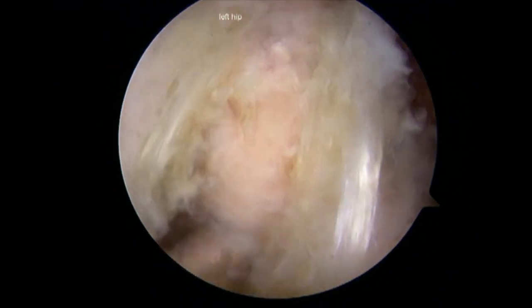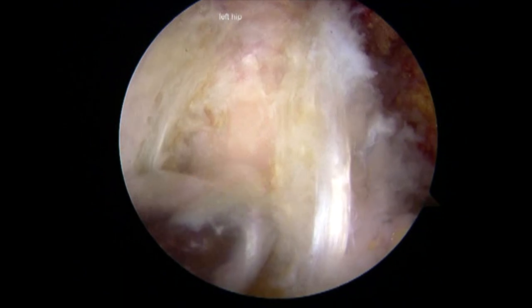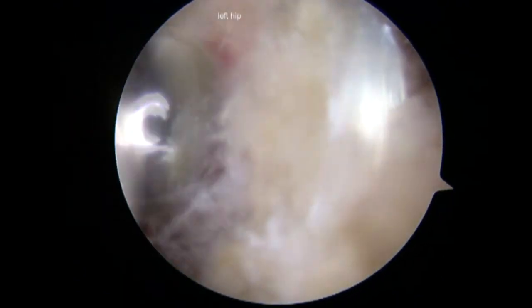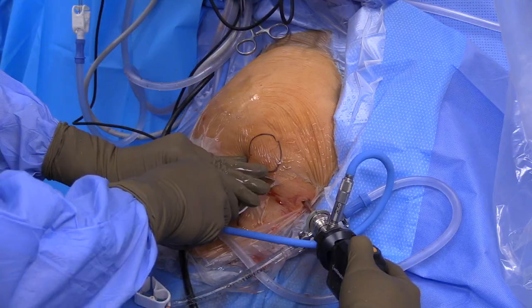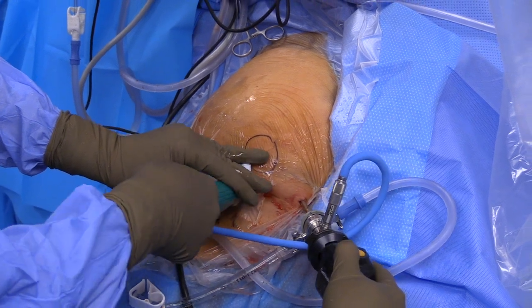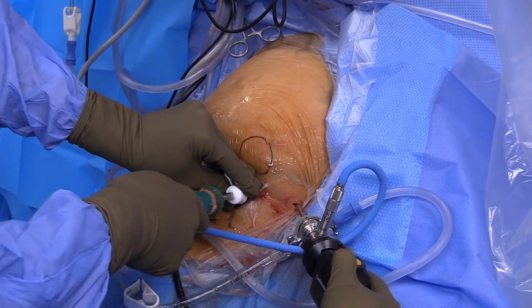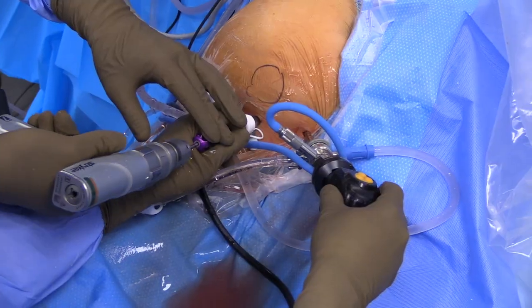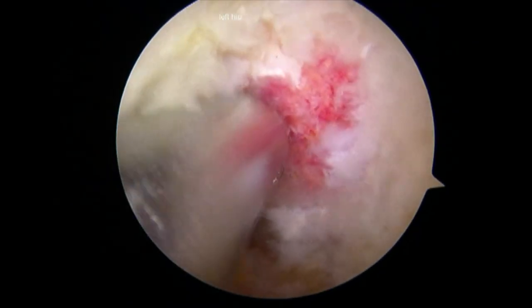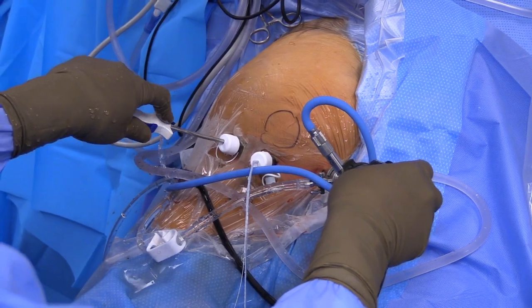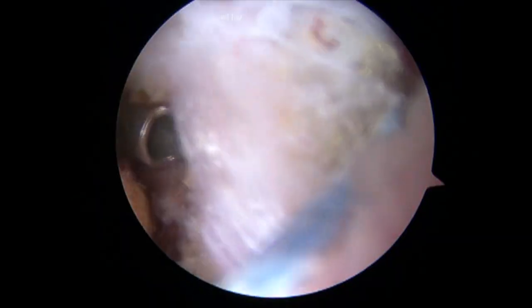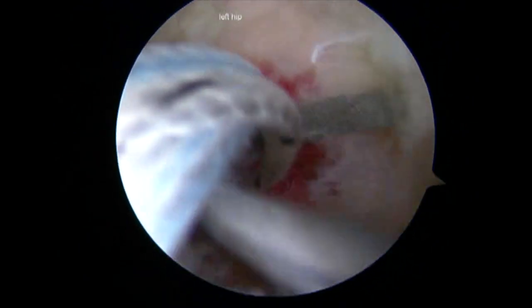The shaver was again utilized to clear soft tissue from the ischial tuberosity. A burr was then used for decortication to obtain bleeding bone for repair. An 8.5 mm cannula was then inserted for anchor placement, placed lateral to the scope. An anchor was then inserted, and sutures from the anchor were passed using a suture shuttle device into a mattress configuration through the medial and lateral leaflets of the tendon in preparation for repair.